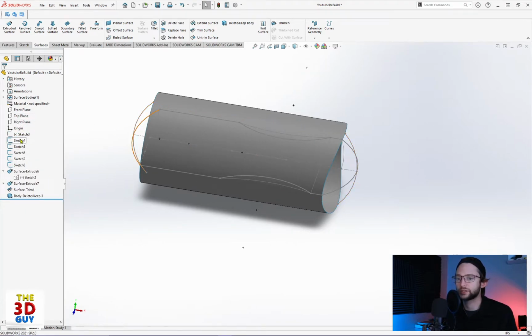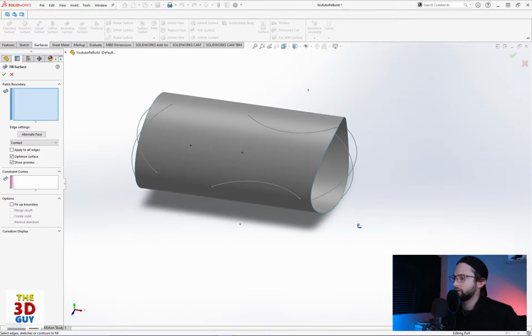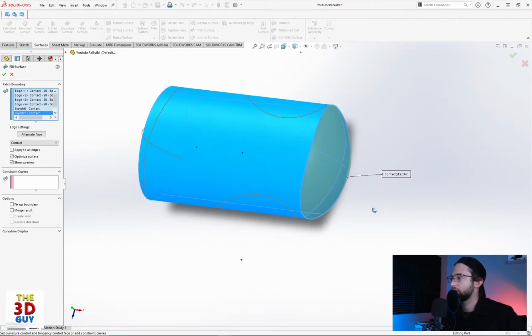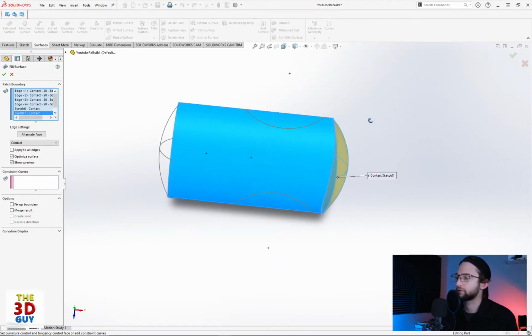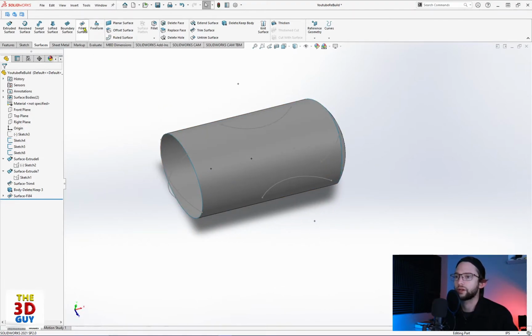You can see some of those lines are still staying because again, those are what we're working with. Awesome. So those are all the actual lines that we're going to be needing as constraints or guide rails. So we're going to use a fill surface. Click on these outside. And it's kind of interesting. Sometimes when you're filling surfaces, it just works with continuing to click on all of the lines for these patch boundaries, as you can see right here. And sometimes not. Sometimes you need to have constraint curves. I'm not quite sure why there's the difference sometimes, and sometimes there isn't, but there is. So we'll do that. And we'll see if this side one will work the same way.